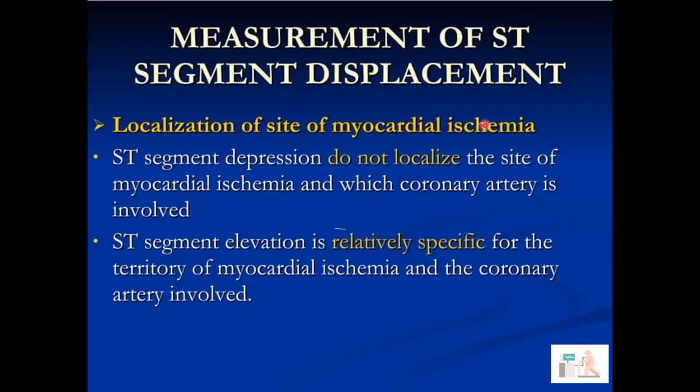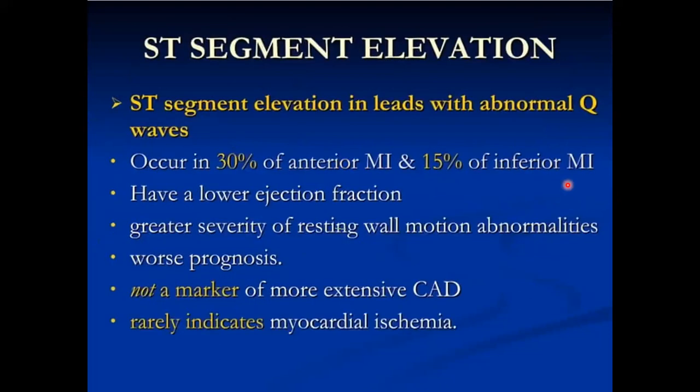So, measurement of ST segment displacement and localization of the site of myocardial ischemia. ST segment depression does not actually localize the site of myocardial ischemia for us. It does not tell us which coronary artery is involved. For instance, if you are having ST segment depression in the inferior leads, it doesn't tell you that the right coronary artery is involved. However, the localization capacity of ST segment elevation is relatively specific for that territory of myocardial ischemia and the coronary artery that is involved.